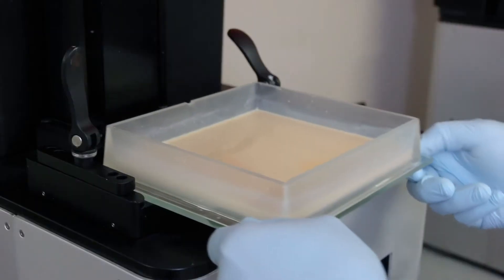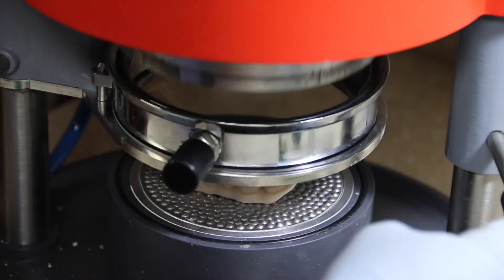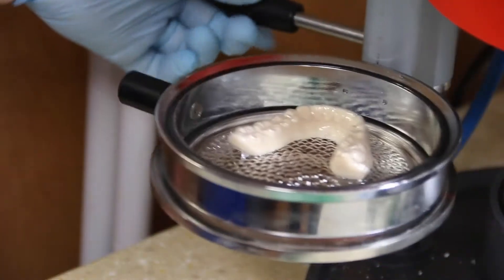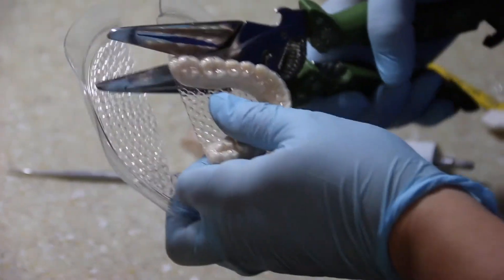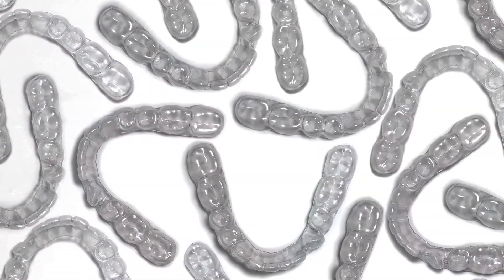Their proprietary e-model material gives us high detail, accuracy, and ease of function, making it effective for our assistants to make clear liners quickly and smoothly. It's a very strong material — it never breaks, it's reproducible, and multiple liners can be made from a single model so we don't have to re-scan and reprint models.